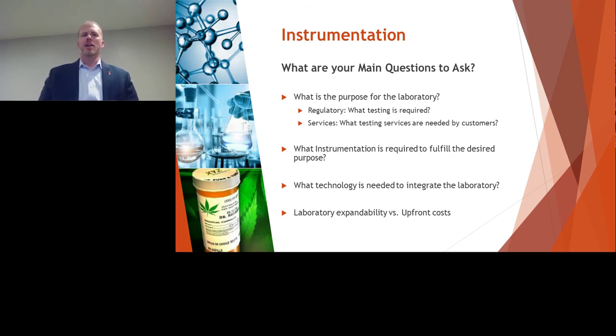And there's also the second portion of a laboratory, and that's your services. Are you doing anything above and beyond those regulatory requirements, or do you have specific testing that is not a requirement, that would be something you're trying to do to meet the needs of a customer? That would be like terpenes or other types of analysis that would give your client more information, sometimes from a marketing standpoint, and other times just something that they need to know about their product to meet their profiles.